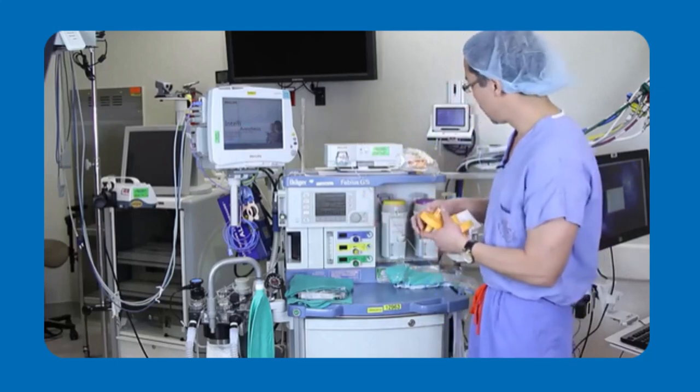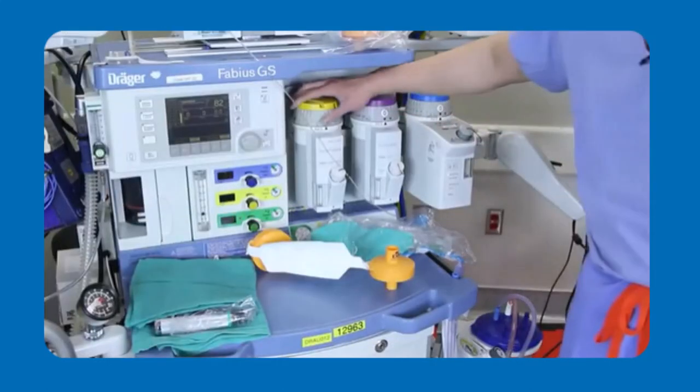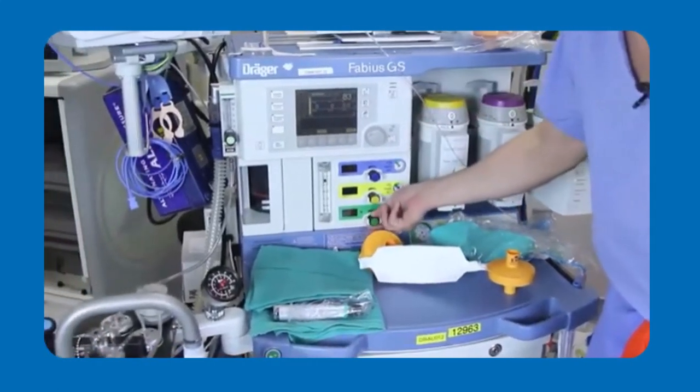In addition to that, to decrease the amount of triggering agent that your patient is exposed to, turn off the anesthetic immediately and turn your fresh gas flows up to greater than 10 liters per minute.